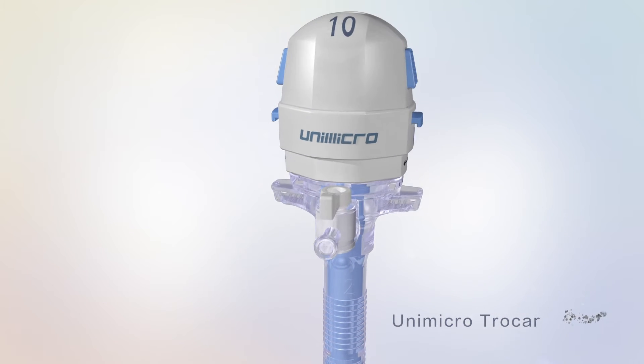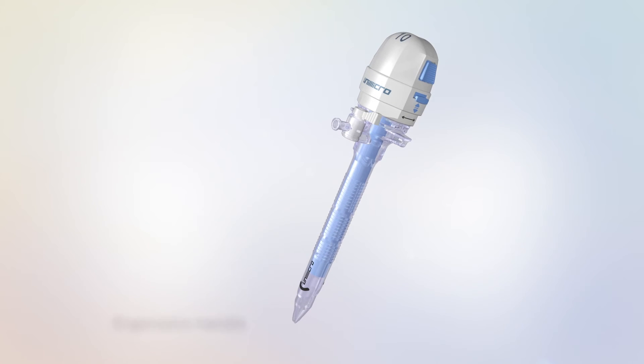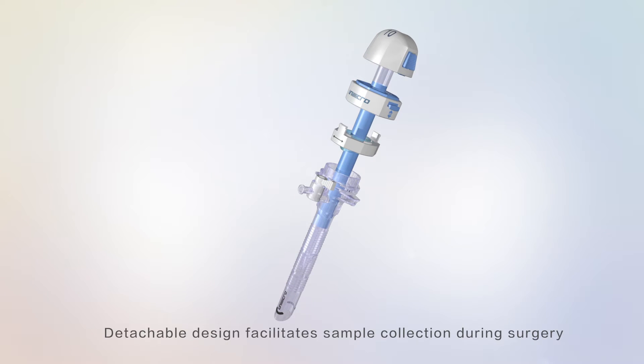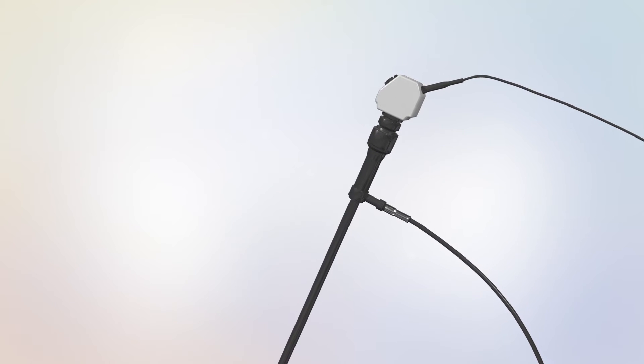Unimicro launches the Detachable Visible Trocar, with its ergonomic handle, innovative Inverse Triangle Cannula, and 100% silicone universal seal, which is convenient for specimen collection and surgery.